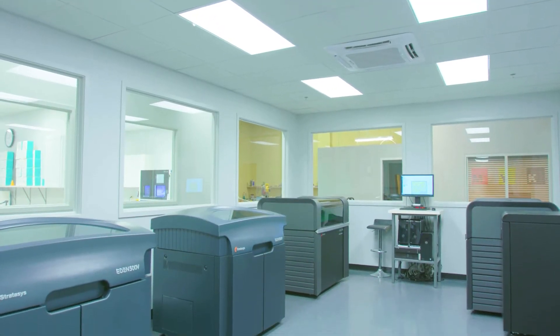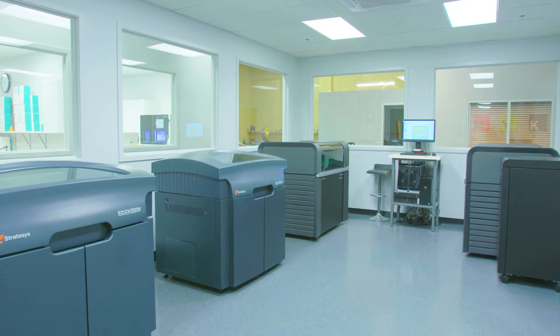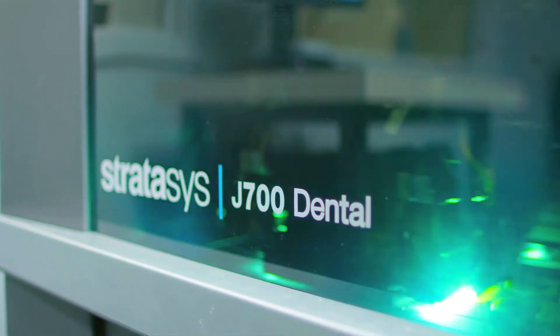We built our new 3D center so that we could hold the three 500 series printers we already have, and also hold three 700 series, one of which we've already purchased.